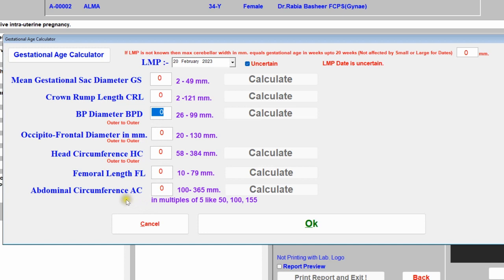One important thing about abdominal circumference: you should enter it as multiples of five — like 50, 55, 60, 65. It can never be between 62 or 63; it should be either 60 or 65, or 70, 75, 80, 85. It must always be in the form of multiples of five.